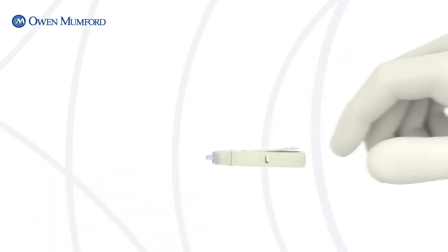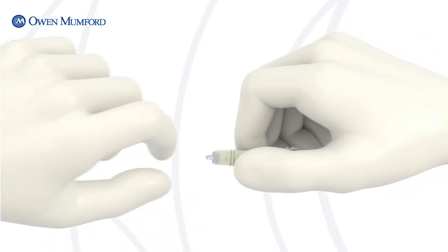To remove the sterile cap, hold the device from the sides and twist the cap a quarter turn to unlock. You'll feel the cap advance forward, but do not pull. Continue twisting until you feel it separate from the device.